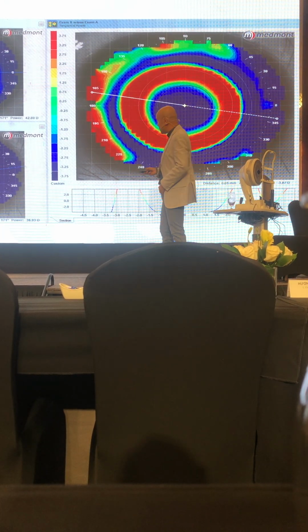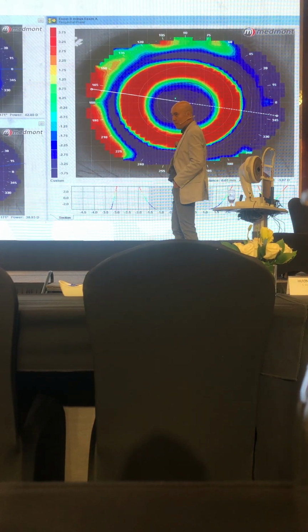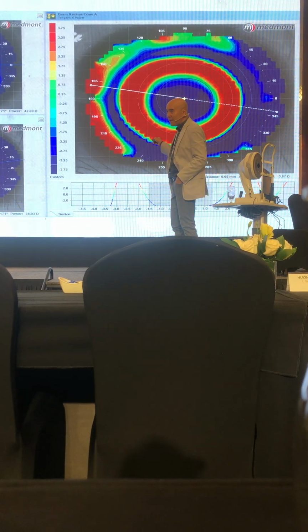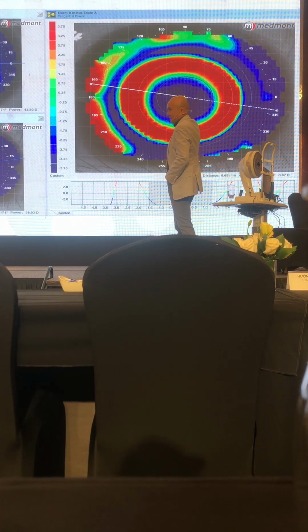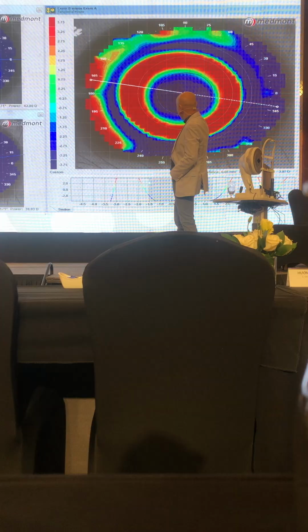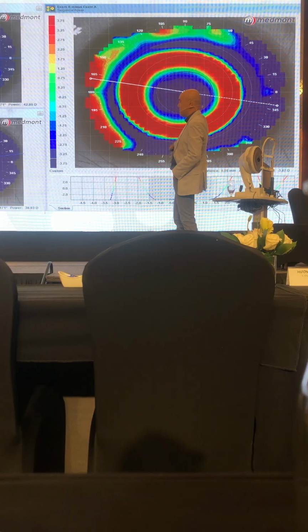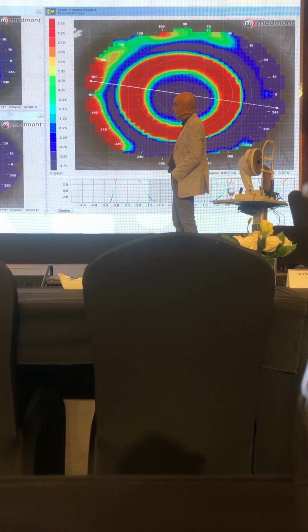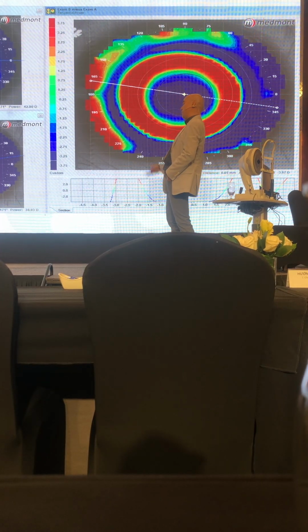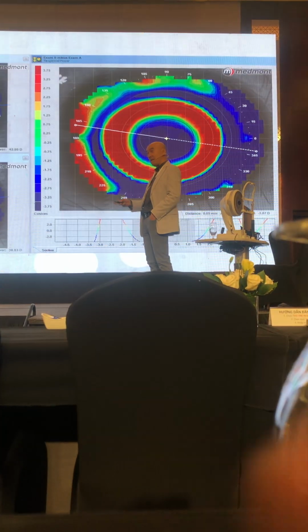Then all we need to do is design the lens which has a smaller treatment zone, and also determine whether you have created enough defocus by looking at the amount of the steepening zone that you created from here. Ideally, you're looking for about 3, 4, or 5. 7, the more the merrier. 7, 9, I love it. Perfect.